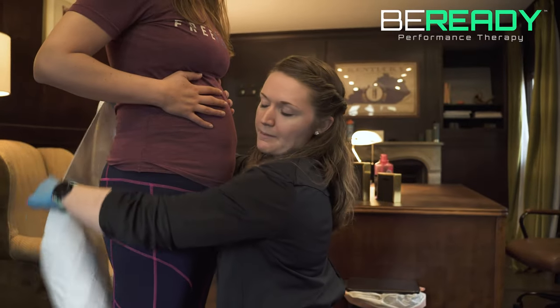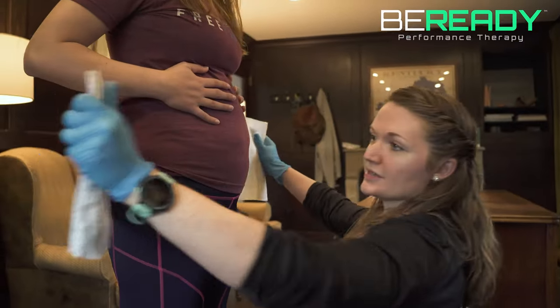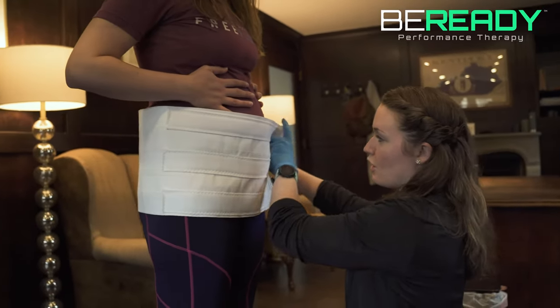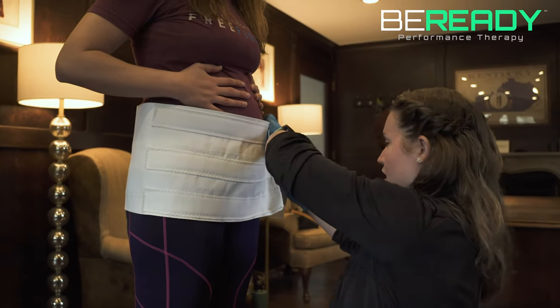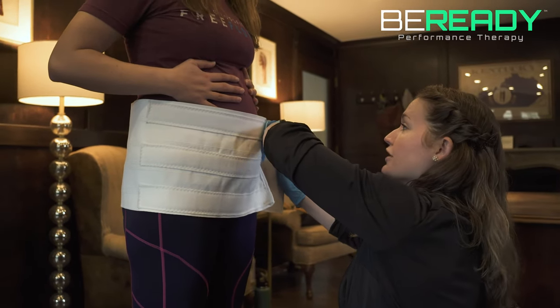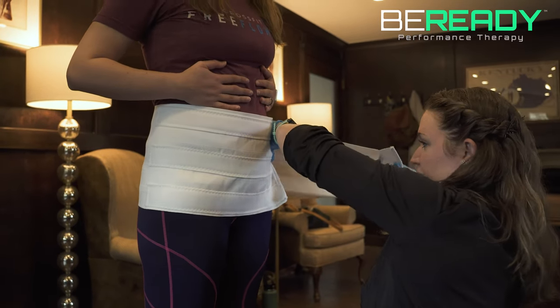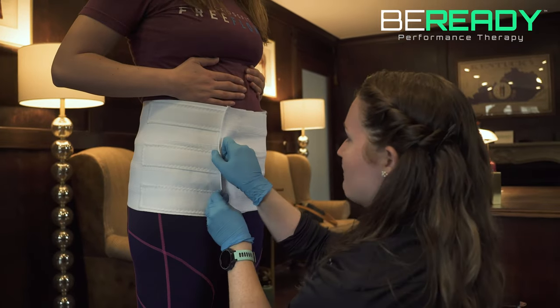I'm going to wrap this around the belly. I'm going to bring the bottom of this binder around towards the pubic bone so it's sitting low over the hips. I'm going to hold the top corner of this binder, have you take a deep breath in — big breath out — and give a nice tight pull, then attach that Velcro.